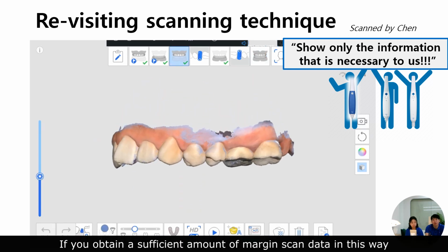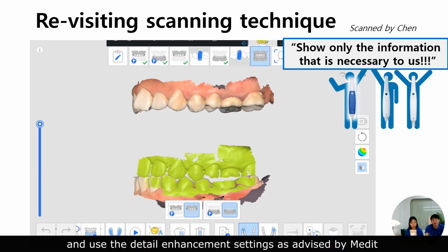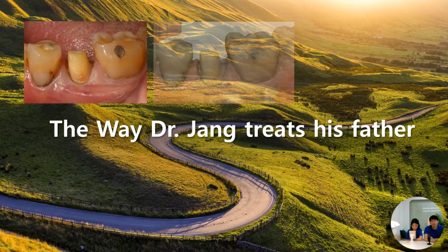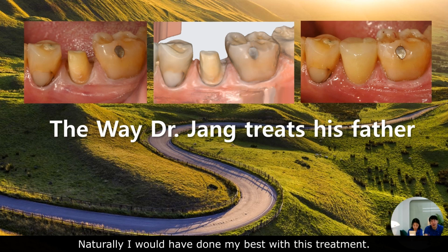If you obtain a sufficient amount of margin scan data in this way and use the detail enhancement settings as advised by Medit, even difficult scans would retain their details. The case we are looking at right now is when I treated my father. Naturally, I would have done my best with this treatment.